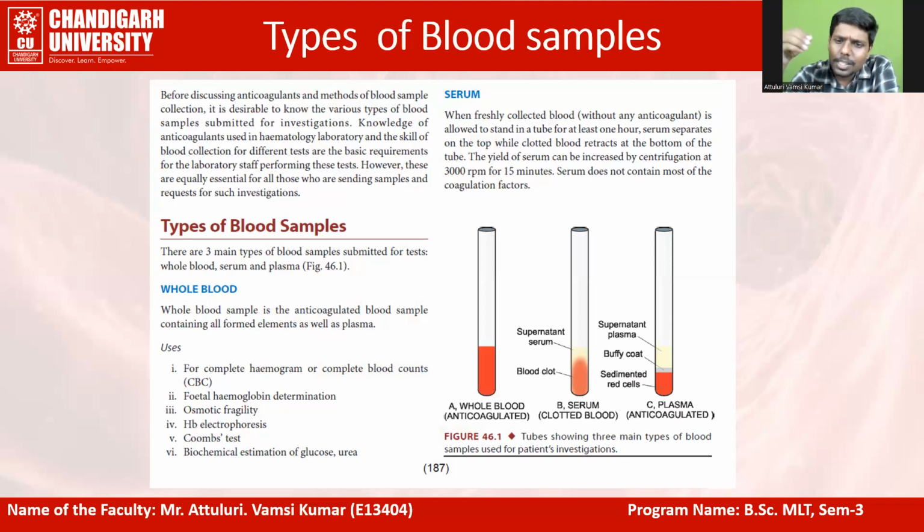That's why this rapid antibody testing department is called serology, because we are taking these antibodies which are present in the serum, and we will subject them to many rapid card tests like rapid HIV, rapid hepatitis, malaria, syphilis, VDRL. All these tests are based on the serum. So serum is a product of clotted blood, whereas if you are adding anticoagulant, then the blood won't be clotted.